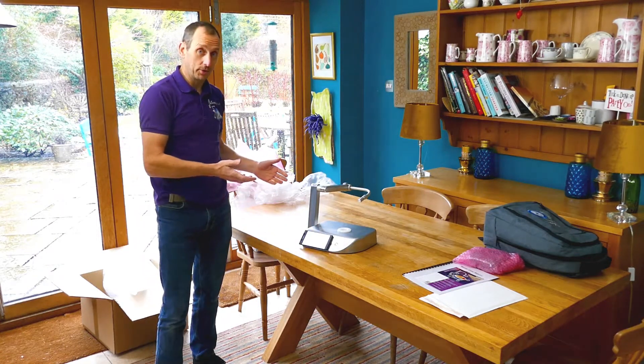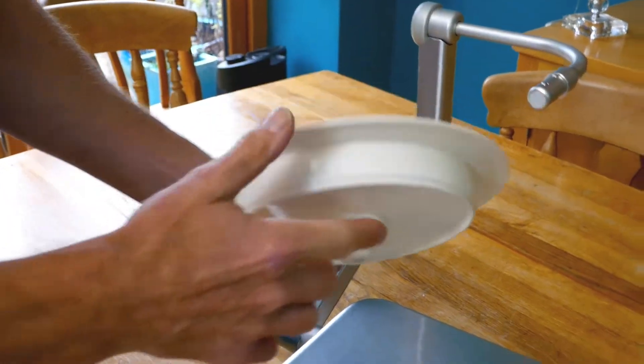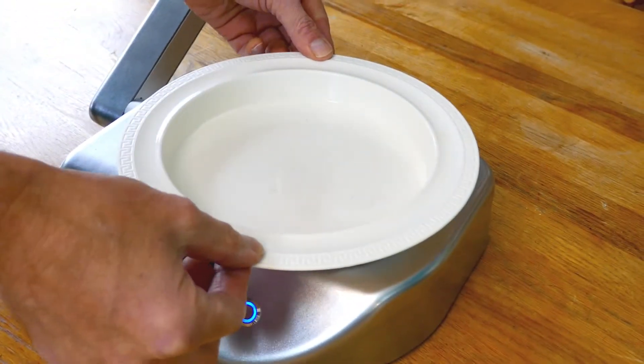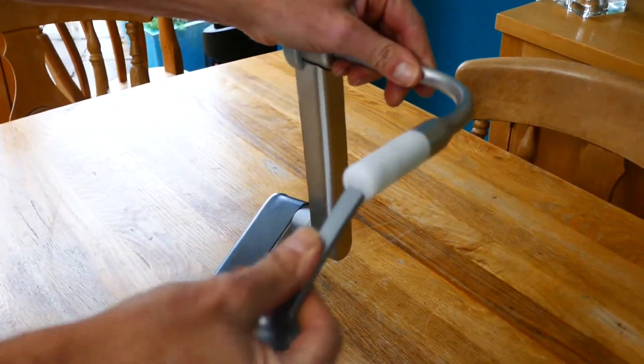There will be a second box with your robot which will have all the accessories that you've ordered with your robot. I'm just going to use a plate and spoon that I have to hand. Please wash your plates and cutlery before use.